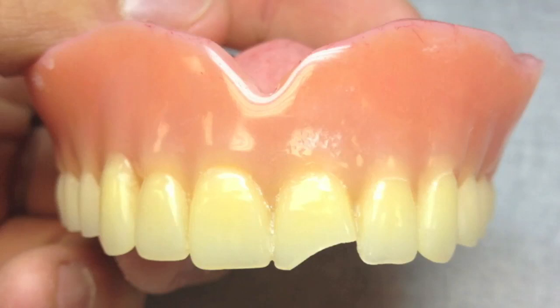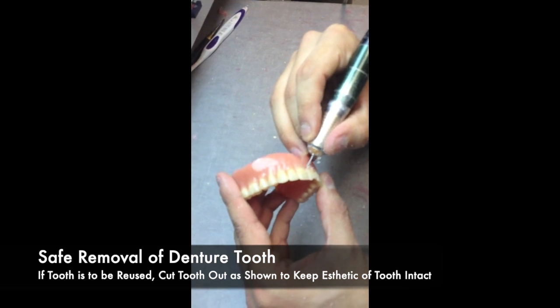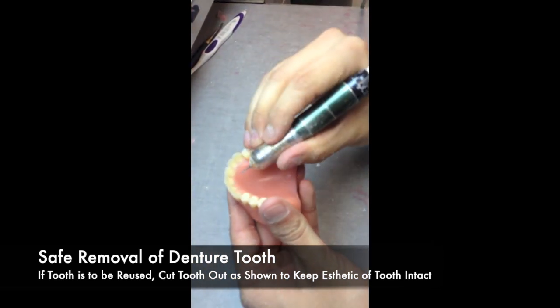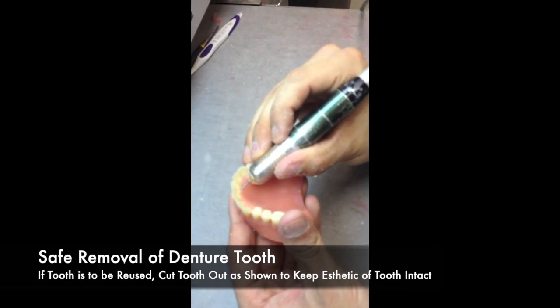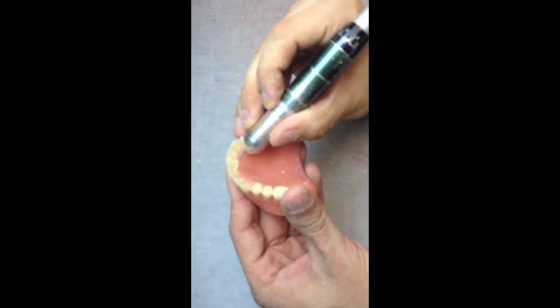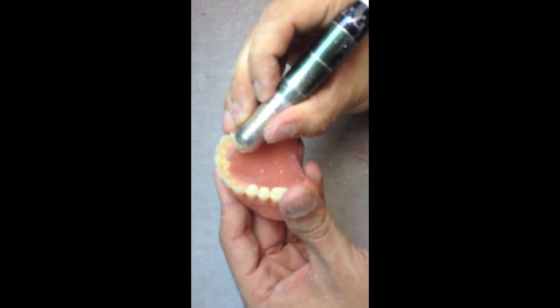This video shows a demonstration of the safe removal of a denture tooth. If a tooth is going to be reused, cut the tooth out as shown to keep the aesthetics of the tooth intact. The scenario in which a denture tooth has been processed in the incorrect position may result in you wanting to retrieve the tooth without having to use a new one. This is solely due to processing errors.